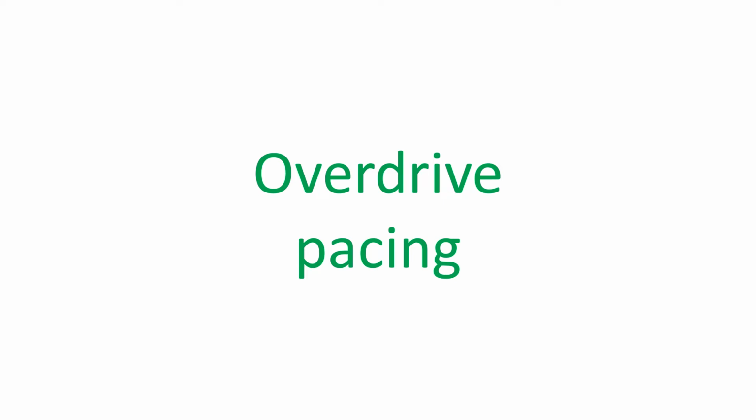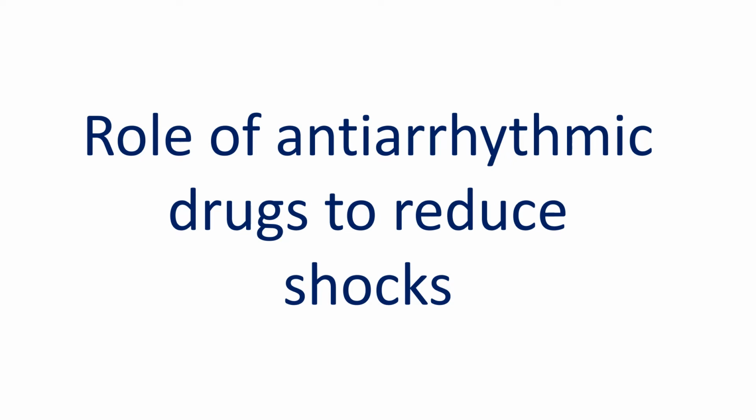All fast ventricular tachycardias and ventricular fibrillation usually receive shock as the first option, though overdrive pacing has been used in fast ventricular tachycardia as well. The battery life of the ICD depends on the number of shocks it is called upon to deliver and the energy levels needed for each shock.